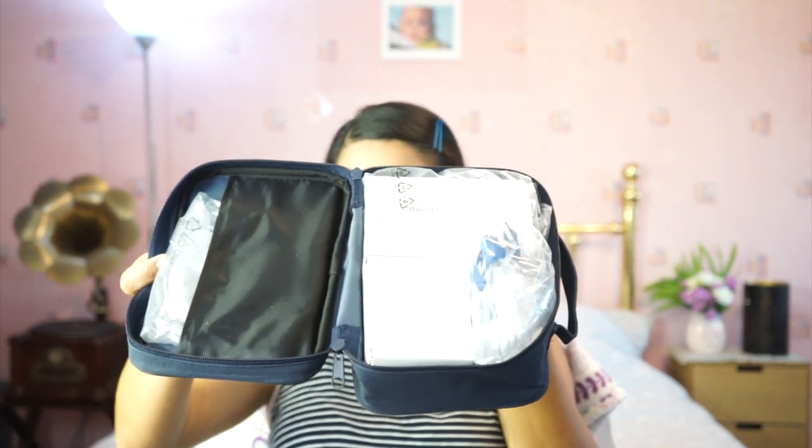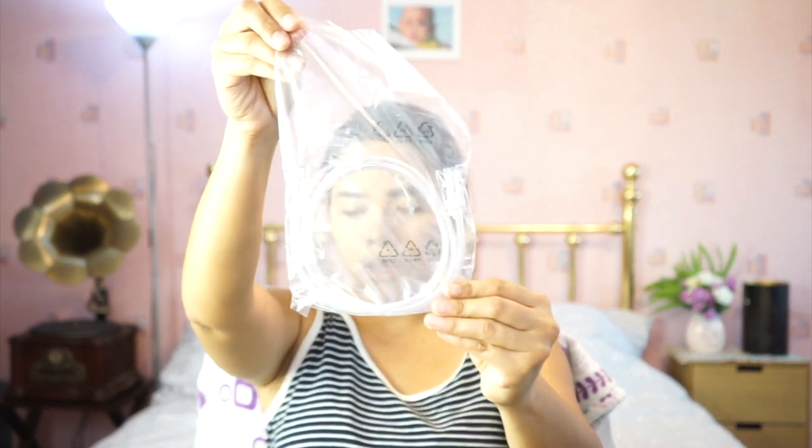Now let's open the box. Once you open it, there's a pop-up showing what you'd expect in the kit. It's a bit dark in the lighting here but you can see the tubing — I think I can reuse the tubing from the old one. And here is the mask; it comes with two masks.